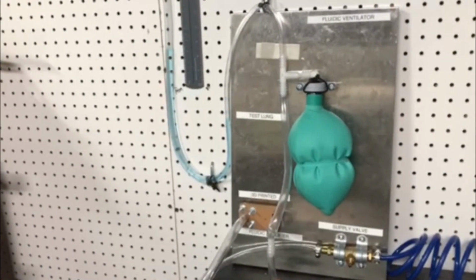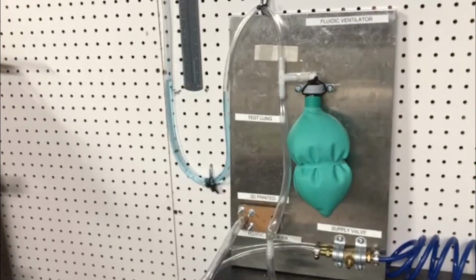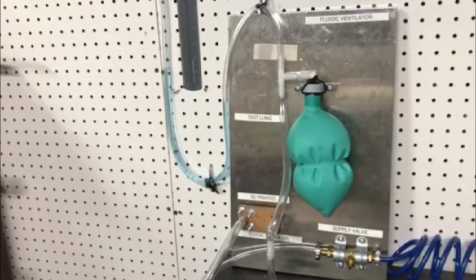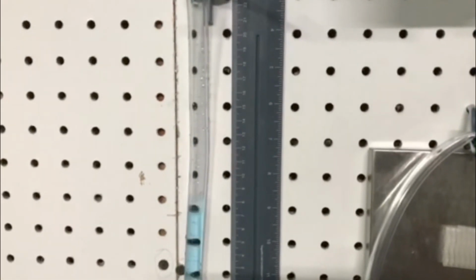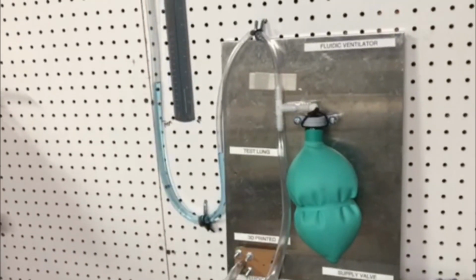And here's another design by Jake Lunde, who uses a different fluidic concept to perform the same timer effect. You can see the different pressures reached in the liquid pressure sensor on the left. We call this measurement device a manometer, and it can be made by anyone with simple tubing and some water.